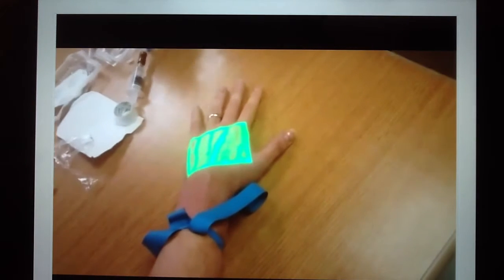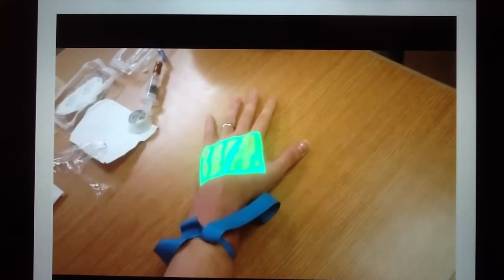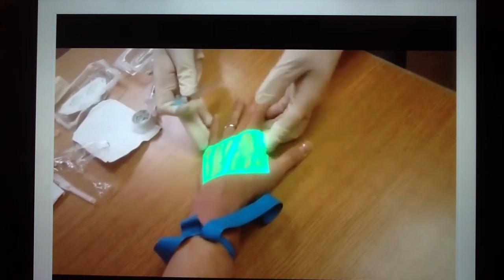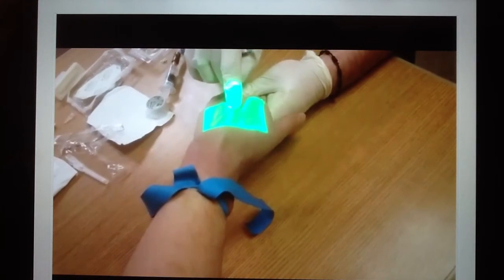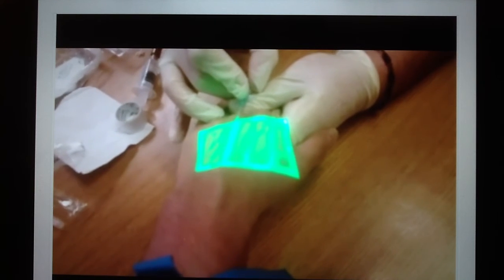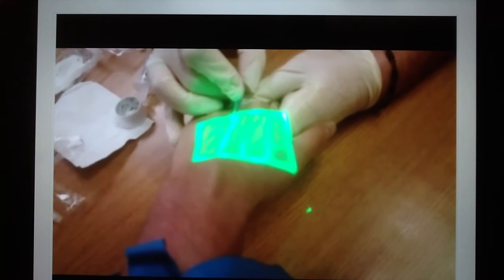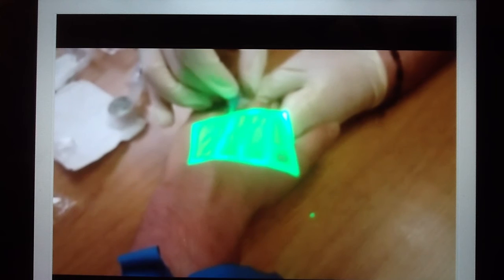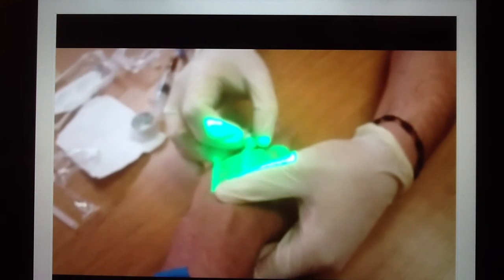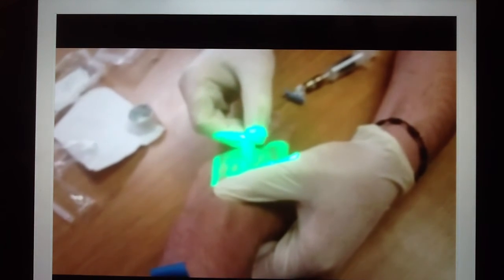I'm now going to show you a brief demonstration of the proper use of the Vain Viewer Flex. The patient's wrist was tied off with a rubber band tourniquet, and the machine was turned on so that I could see the near-infrared light on the patient's hand, which displayed his veins. I chose the largest vein on the patient's hand and palpated it, which showed good rebound. I then inserted a 22-gauge cannula into the patient's hand.